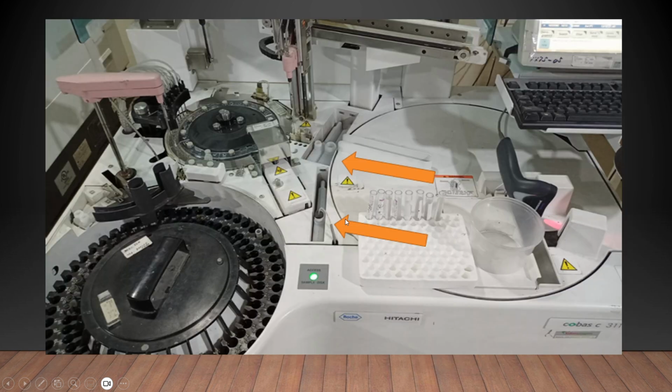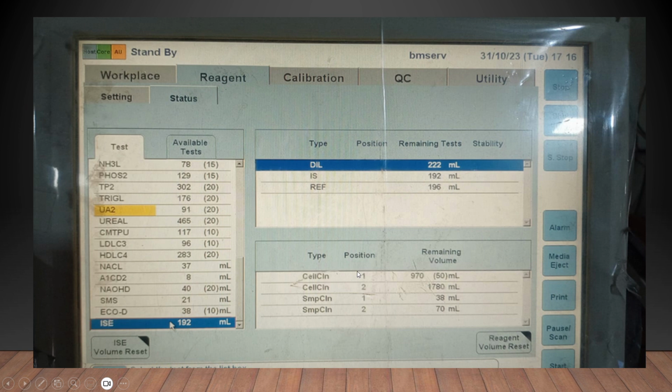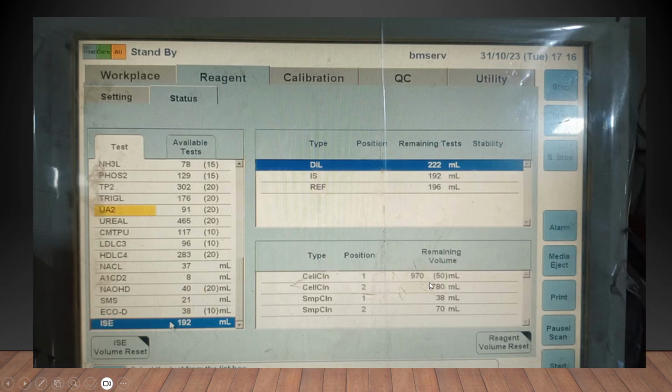Okay, so similarly we also have these detergent solutions. So that is your cell clean 1, cell clean 2, sample cleaner 1, and sample cleaner 2. So this cell clean 1, cell clean 2 are these ones. Okay, this NaOHD cassette is the cell clean 1, then acid wash is the cell clean 2, and then these are all the sample diluents, sample cleaner 1 and 2. 2 is not required for C311 instrument, only 1 is required. Okay, so these also you can reset here directly. So you just have to select it, put a reagent volume reset, it automatically resets.